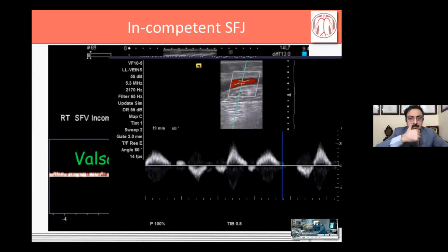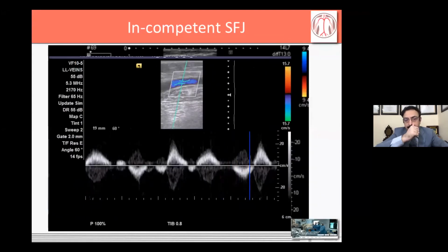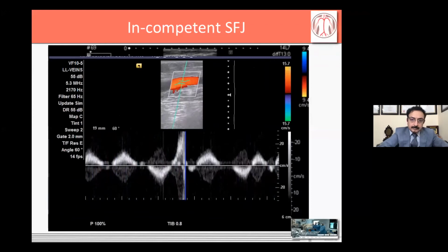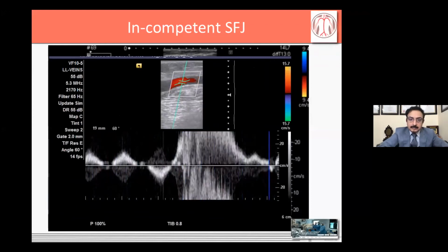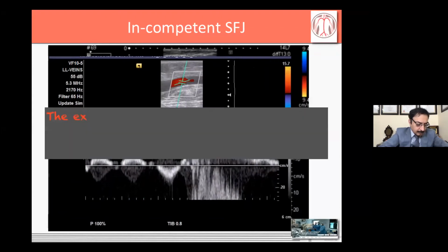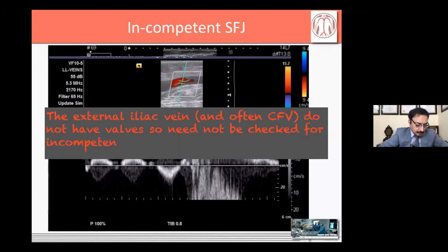So again, this is a flow where you can get mistaken. It's basically an arterialized flow, but the patient may have abnormal structural heart disease, which can be an issue. Sometimes the patient may have an external compression, which can lead to distension of the veins and then secondary reflux. So you have to be aware of that.